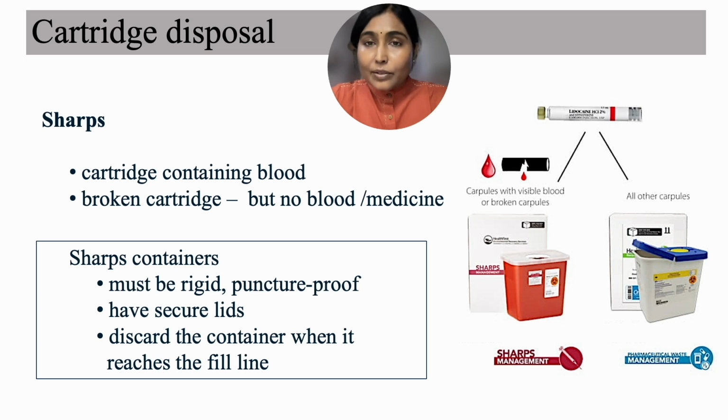Sharps container must be rigid, puncture proof, and have secure lids. FDA also states that sharps containers must be absolutely discarded when reaching the fill line on the label, which is approximately 3/4 full, not completely full. To avoid contamination and injury, containers should not be overfilled.